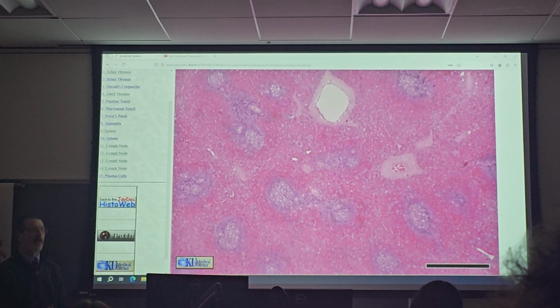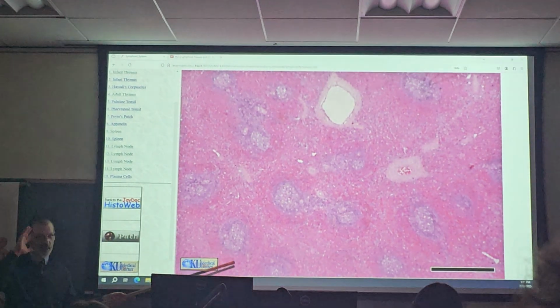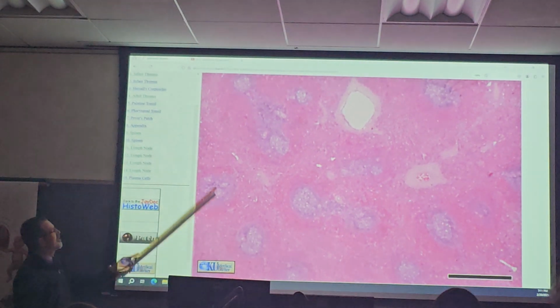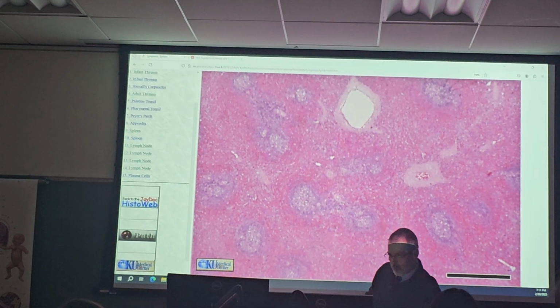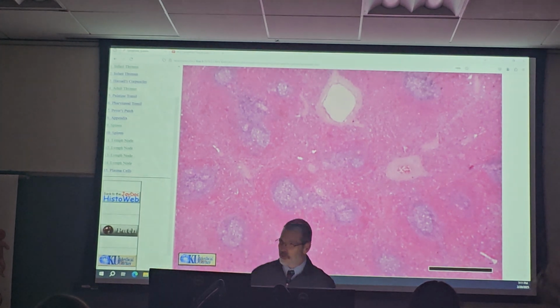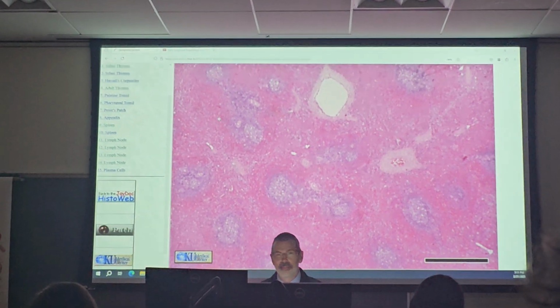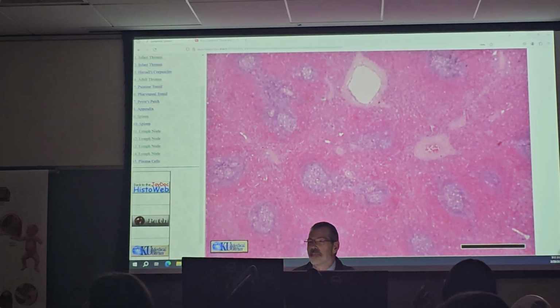Here's the harder question. Where's the white pulp? The dark. In biology land, because of some weird thing, that is white. Don't trust your lying eyes, right? That is considered white pulp, the dark. So you have to just accept that the dark things are white. Don't ask me. It's like white blood cells are dark. It's a weird thing. But white pulp is dark, red pulp is red. And this is a spleen that's splattered. Make sense? I wish they would name it something else. They did not. But I just work here.